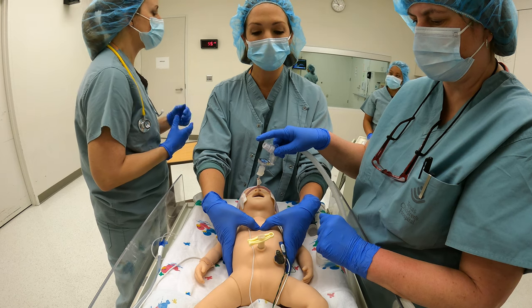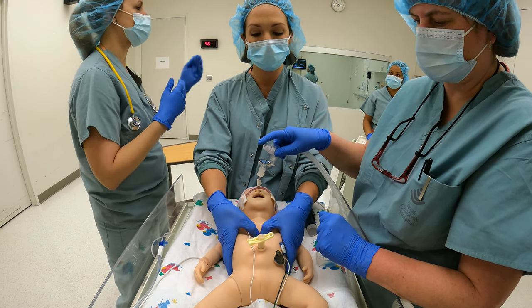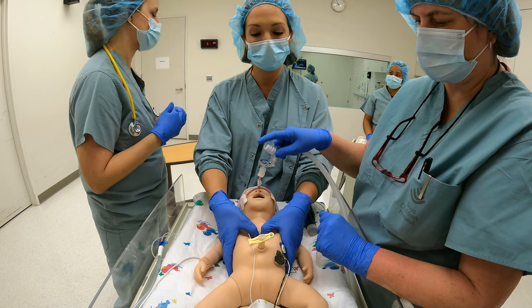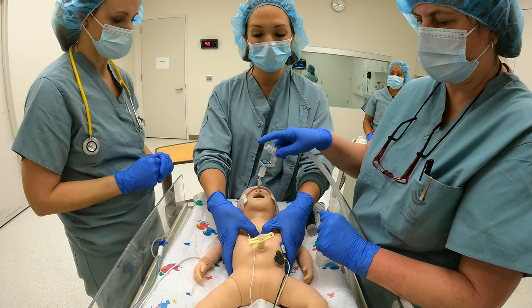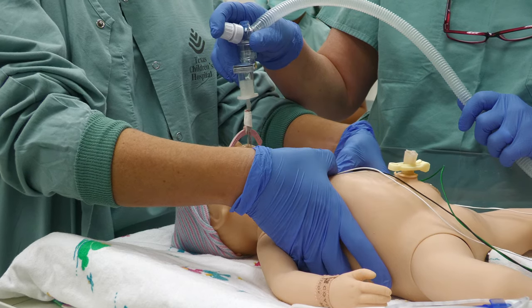Hey, Vanessa, can you please let me know when 1 minute has passed and we'll recheck heart rate? Also, be prepared to switch out with Corey after 1 to 2 minutes of chest compressions. Okay, I will let you know when it's been 1 minute. 1 and 2. Chest compressions will be done from the head of the baby.